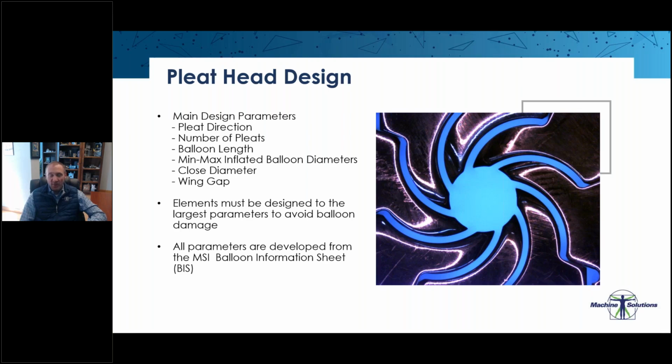If the wing gap or closed diameter is too small, you could pinch the balloon and create some pinholes or damage in that balloon. So we're always looking at the largest parameters to design to ensure that we have no issues with pinching or adverse effects throughout that process. And all these parameters are developed from the MSI balloon information sheet, which will be provided early on in the assessment process to the customer to fill out.